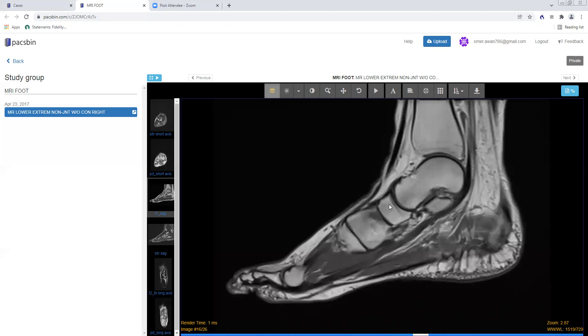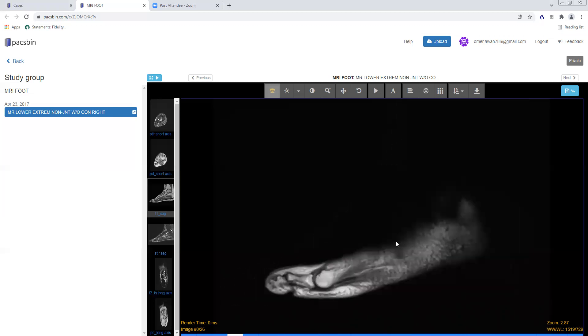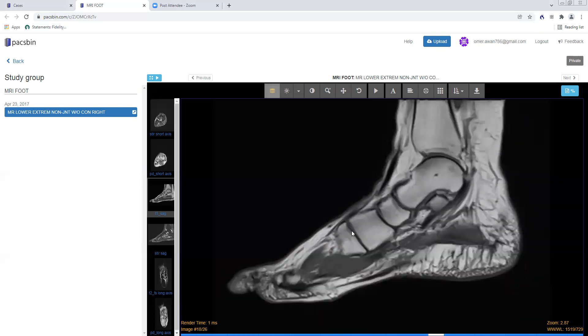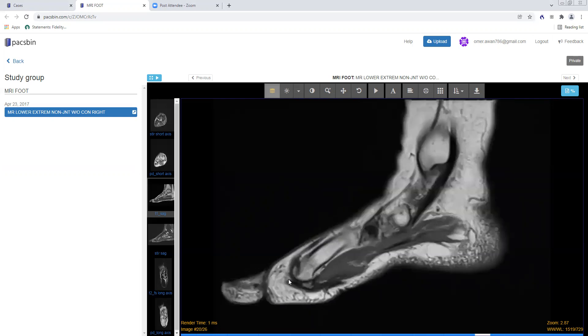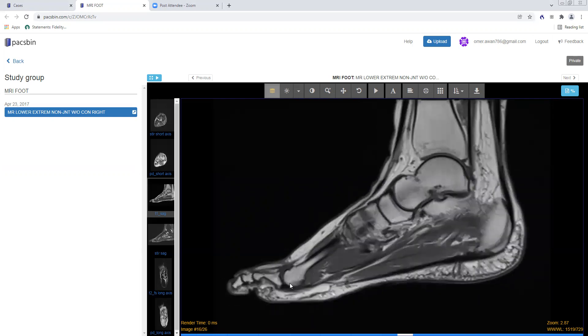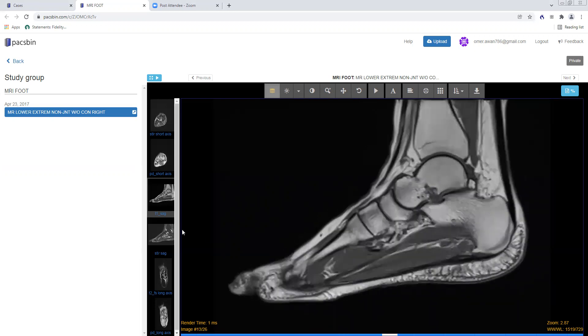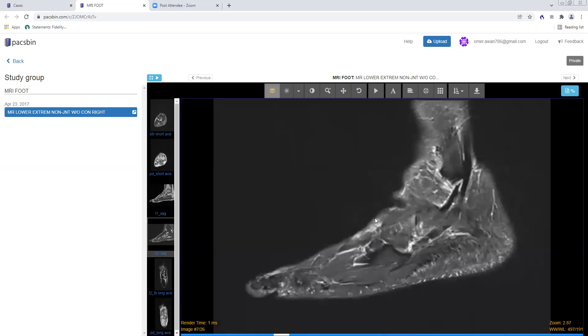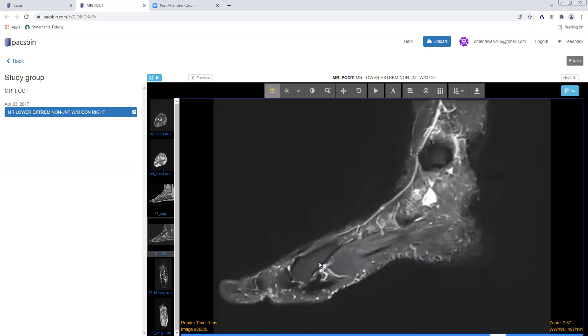The sagittal plane is also good for looking at the alignment at the talonavicular joint and the cuneiform bones. If there's a Lisfranc fracture-dislocation, you'll have offset of the metatarsal with respect to the cuneiform — oftentimes the metatarsal will be dorsal with respect to the cuneiform bones. I want to move to the sagittal STIR images to show a very important structure that is key on the sagittal plane.